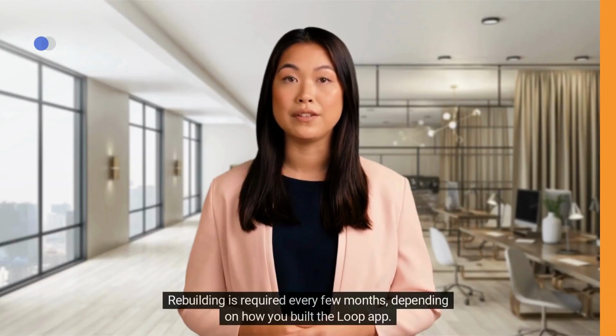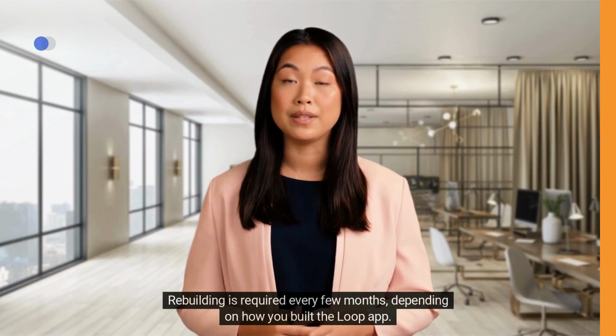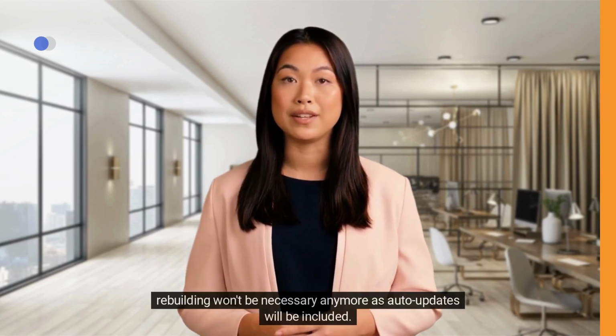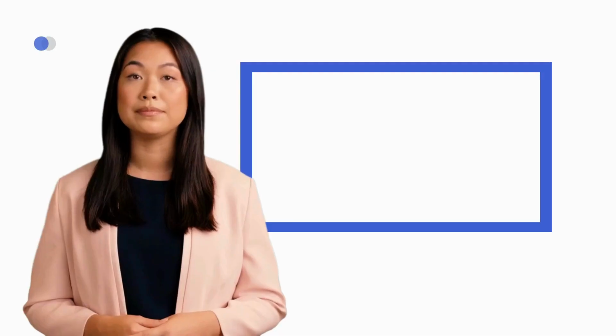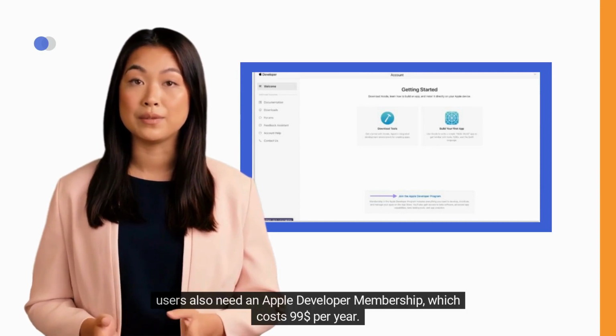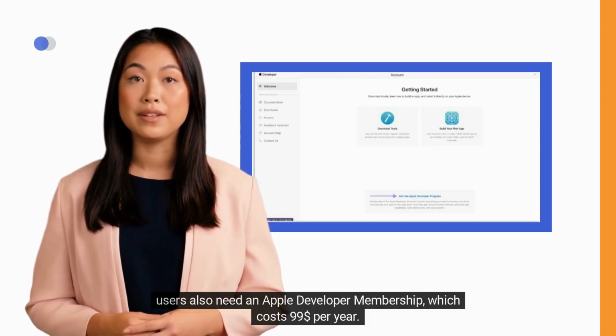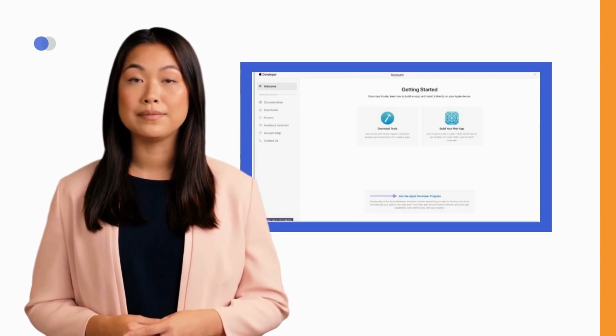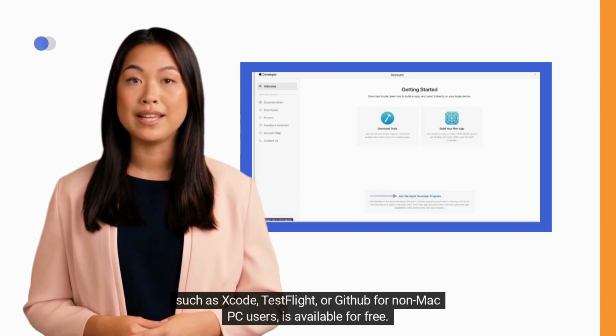Rebuilding is required every few months, depending on how you built the Loop app. With the Loop 3.4 version, rebuilding won't be necessary anymore as auto updates will be included. To build the Loop app, users also need an Apple developer membership, which costs $99 per year. The membership request typically takes 1 to 2 days for approval. Other necessary software, such as Xcode, TestFlight, or GitHub for non-Mac PC users, is available for free.